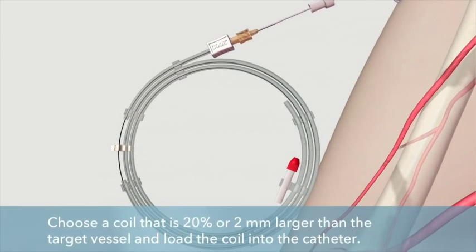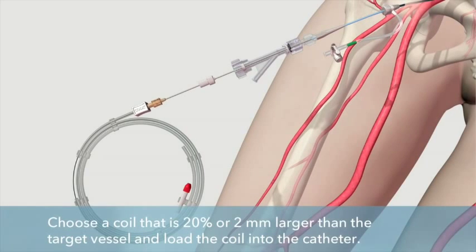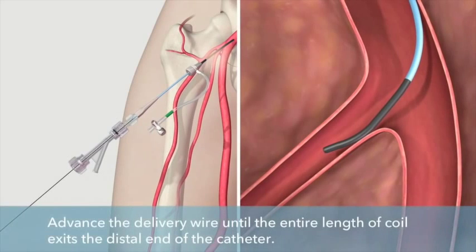Remove the white safety clip from the delivery wire and advance the delivery wire into the catheter. Once the delivery wire is in the catheter, unlock the loading cartridge. While holding the delivery wire stationary, remove the delivery wire holder and metal loading cartridge.